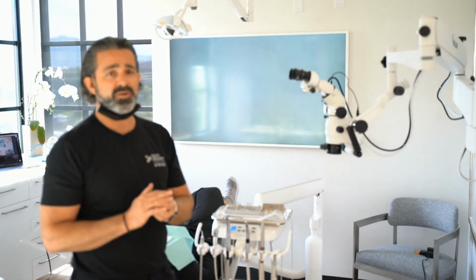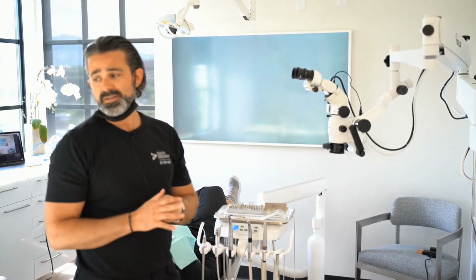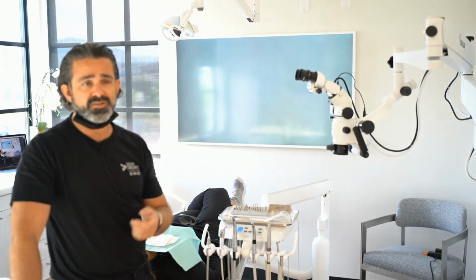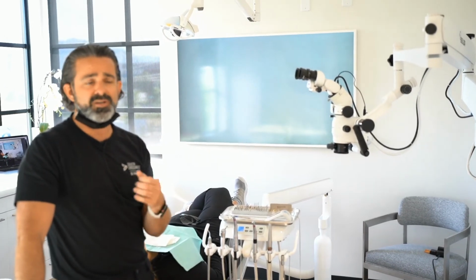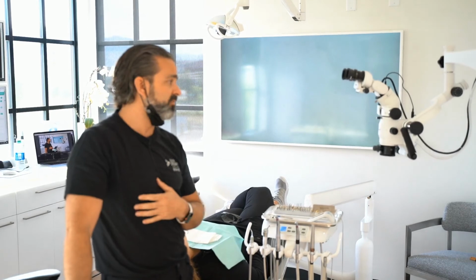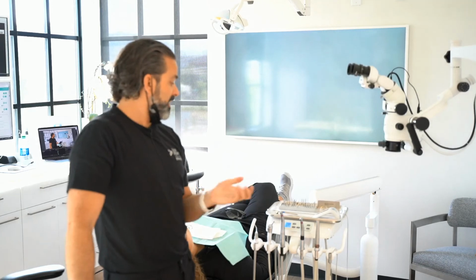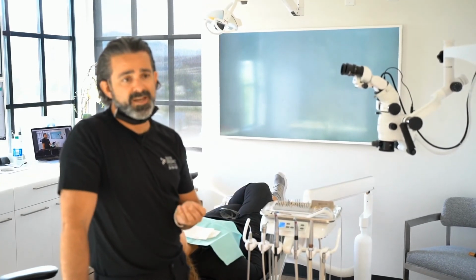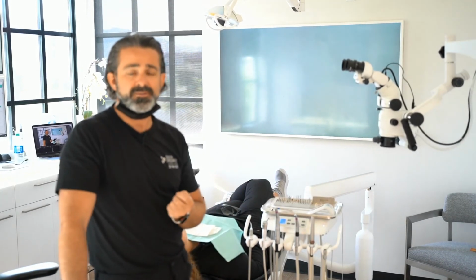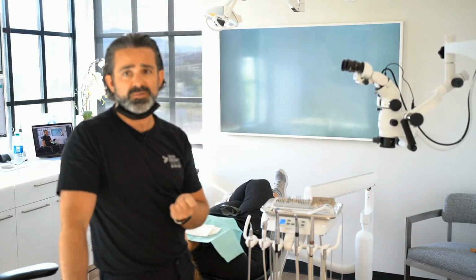Mirrors are also really important. I commented earlier that I do a lot with indirect. And so having a mirror that's not scratched, that hasn't been put through sterilization 101 times, or going to a rhodium mirror, something that's very bright, you'll find yourself having special mirrors for the microscope or even for photography under the microscope. I use different mirror sizes. That also helps with positioning around like distal lingual line angles, things like that. But I think that's true probably with loupe dentistry as well.